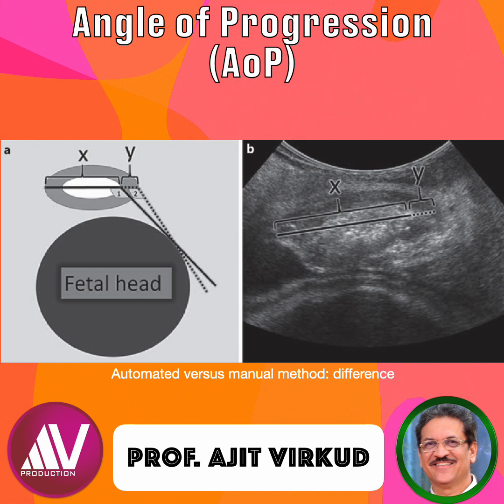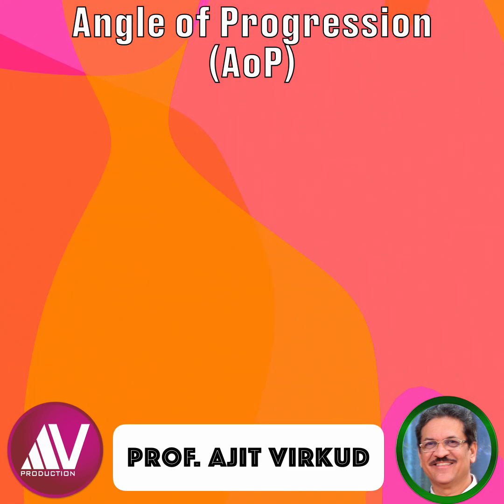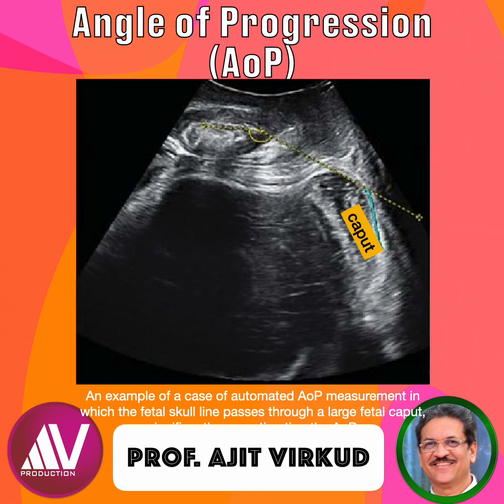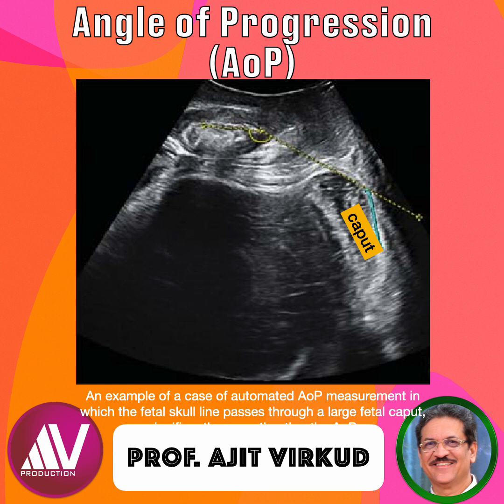There is one drawback of automated measurement. Here is an example of automated AOP measurement in which the fetal skull line passes through a large fetal caput, significantly overestimating the angle of progression. This can be avoided by manual measurement, which allows the operator to avoid the caput.